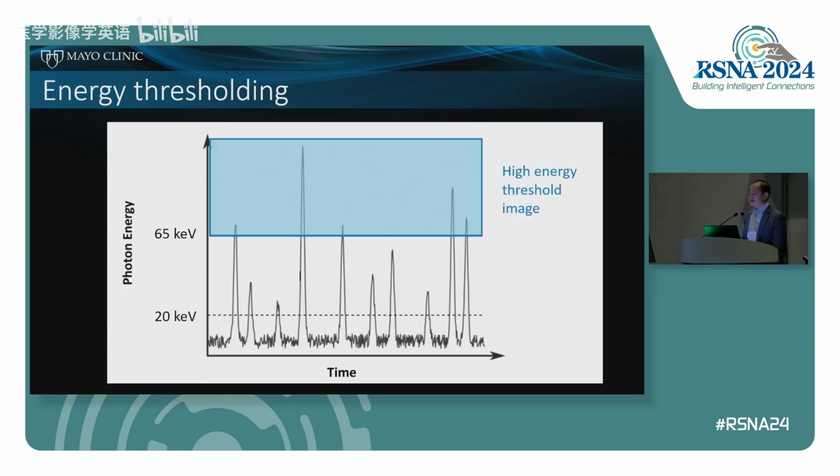In photon counting CT, we call this high energy threshold data, and the previous one low energy threshold data. On the commercial CT scanner we have now, you might see the word T3D. It's basically the low energy threshold that puts all the photons above 20 keV. It's very similar to conventional single energy data. But because we have two measurements, we can actually manipulate between those two and do some operations. For example, we subtract between them. That gives us so-called energy bin images.